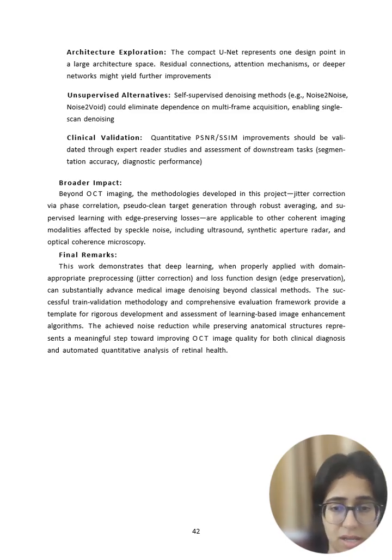The successful methodology and comprehensive evaluation framework has helped us to finally complete this project. The achieved noise reduction while preserving anatomical structures represents a meaningful step towards improving OCT image quality for both clinical diagnosis and automated quantitative analysis of retinal health.